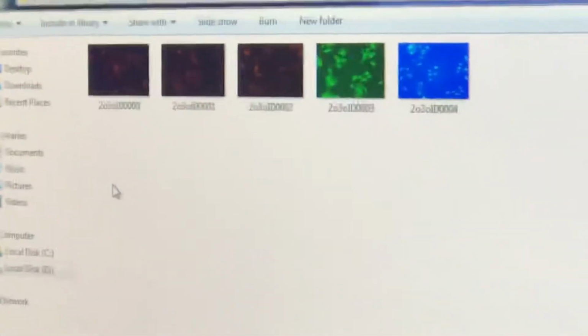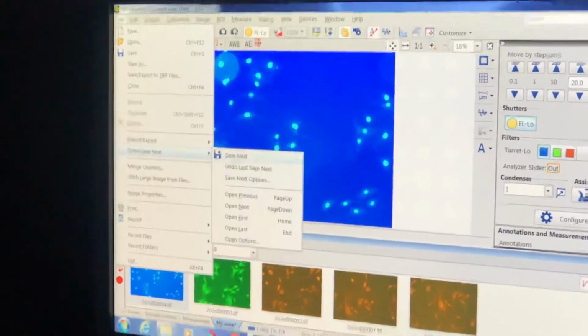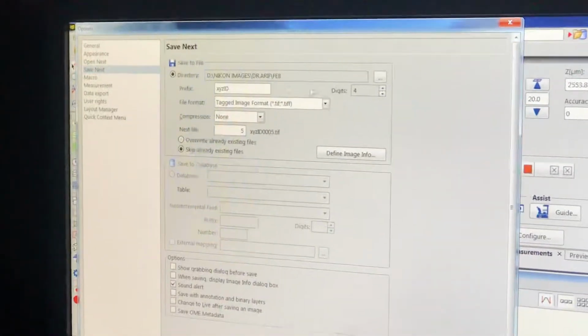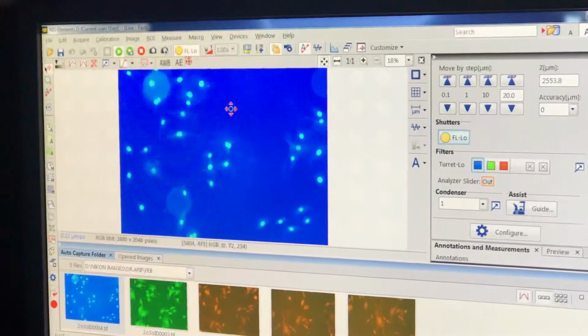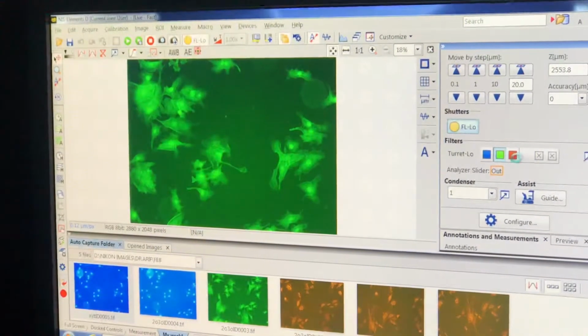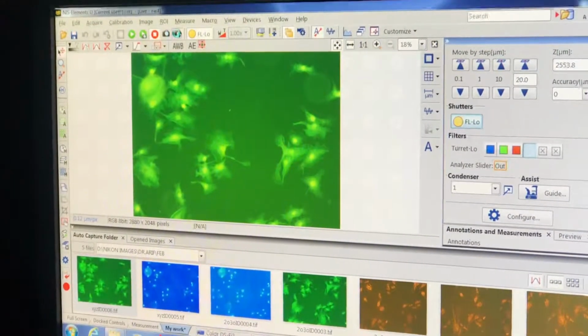Now next, the same day, you came across another patient. So what you will do, we will go here, file, open or save next options. You will just change this ID. Let's say this ID is XYZ. Apply. Now first live. Do like this. Capture. Capture. Capture.